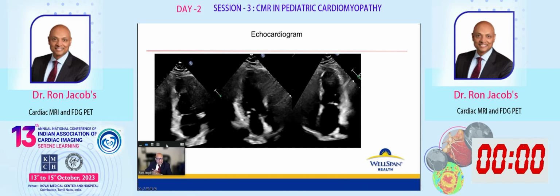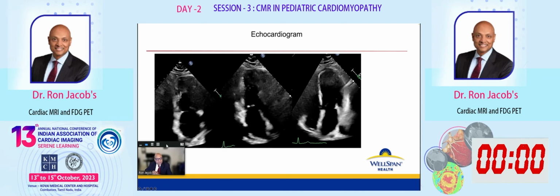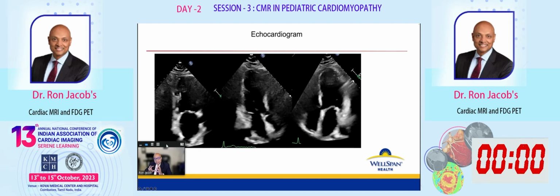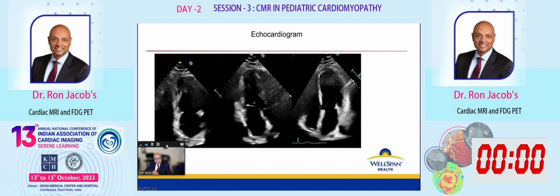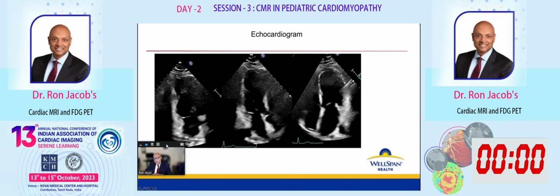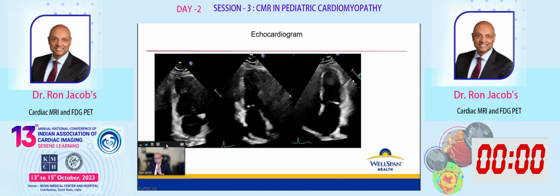This is our echocardiogram: slightly thickened valves, overall normal function, Doppler not really showing anything. The LV function looks preserved. I would have probably given contrast. In fact, we did have contrast images, and the EF was 55 to 60% with contrast. The right ventricle, as you can see, is not well visualized. In summary, you have this patient with not much in the way of past medical history, who comes in with an advanced heart block, relatively young to have conduction system disease, and a preserved ejection fraction. So really the question is, what should we be doing in these patients? When you see conduction blocks in a young patient, that should always raise a red flag.